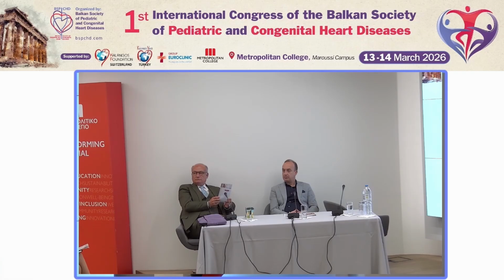Željko Đurić, cardiac surgery. So I have a question. When you would estimate regurgitant volume or ejection fraction, you would rely on MR or echo? If you can have MR, you would choose MR. But it is a very expensive modality. It is not portable. Very small patients have a problem with staying still. So actually, it is a luxury.